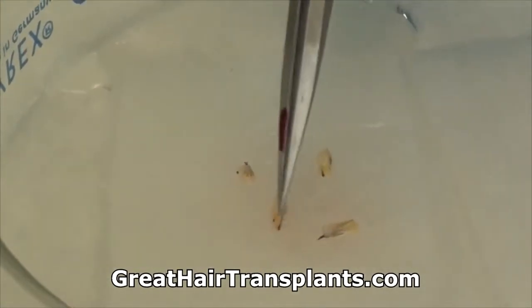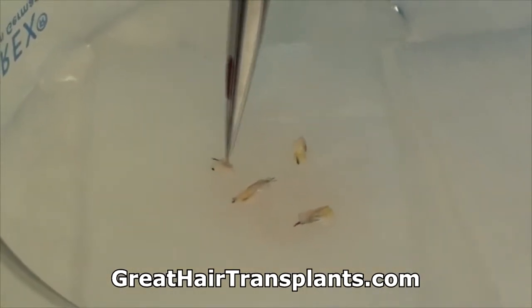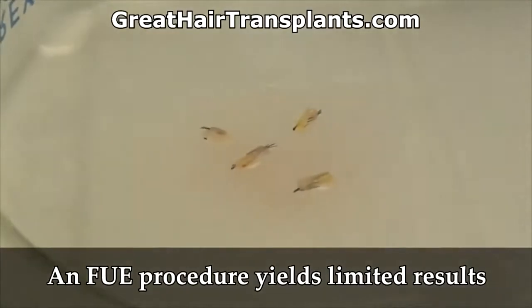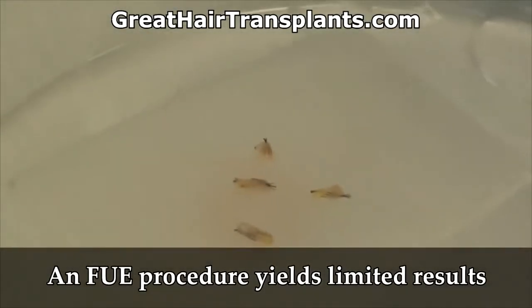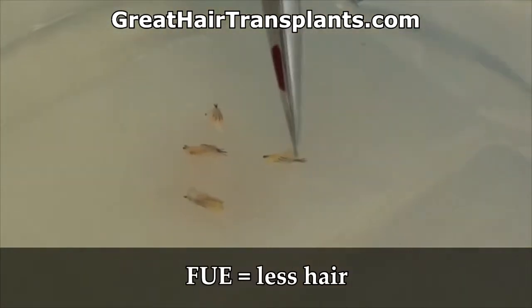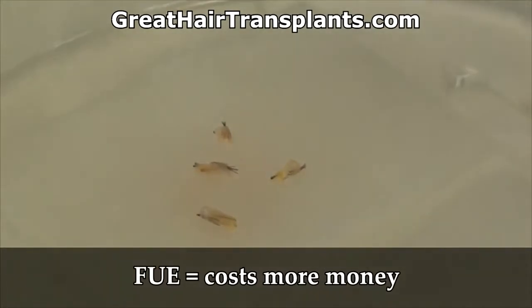This one, we got 2 bulbs and cut 2 hairs. This one, we cut all the hairs. This one, we got 1 bulb and cut that hair. So this is what happens with a follicular unit extraction. You get limited results. You get less hair, it takes more time, and it costs the patient more money.